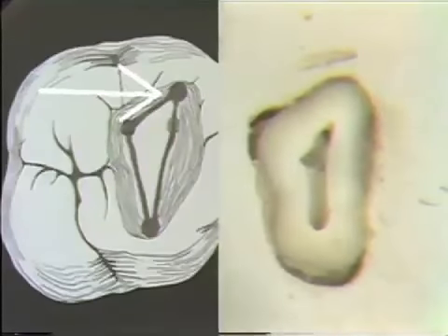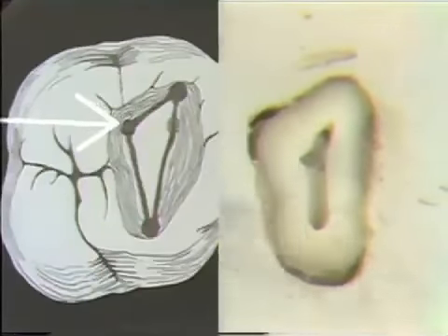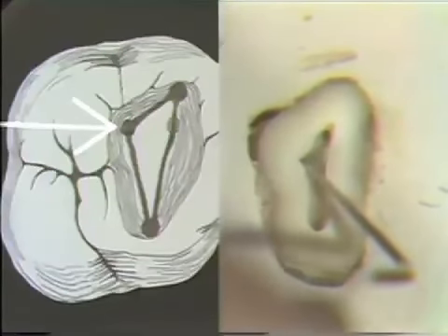The distal buccal canal is not so far to the distal, and it's not underneath the distal buccal cusp, but sits fairly close to the mesial buccal canal and always lingual to it.